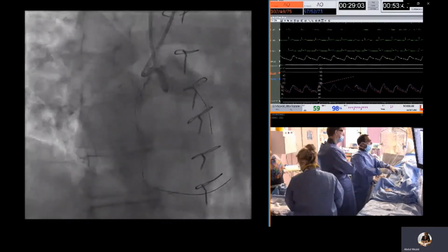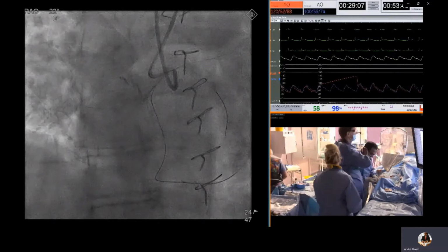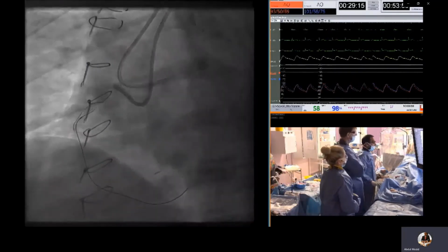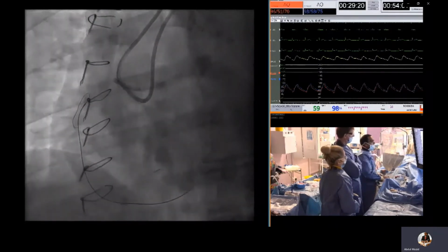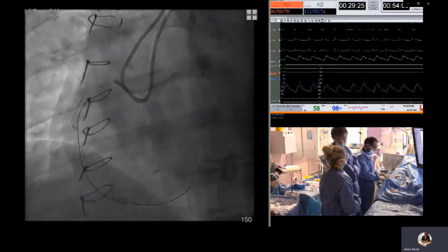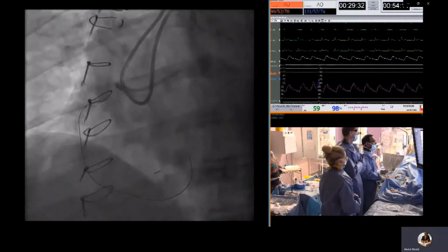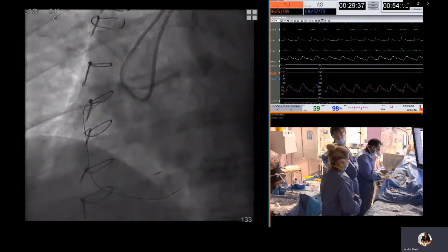So you can imagine trying to wire this retrograde with stiff wires would have proved very difficult and potentially dangerous, with likely exit of guide wires. But with a knuckle wire, we are able to stay within the vessel architecture at all times and clarify the course of the artery. So here the Mamba Flex catheter was easily advanced following the guide wire and is pushed on further all the way to the proximal cap.